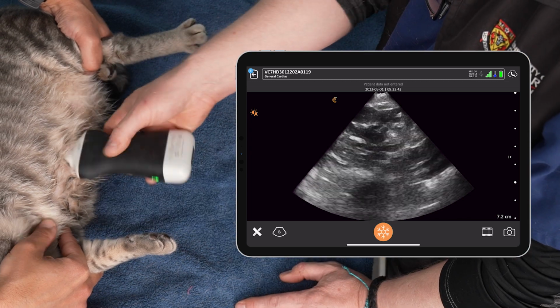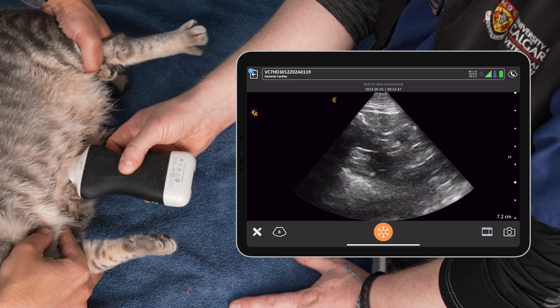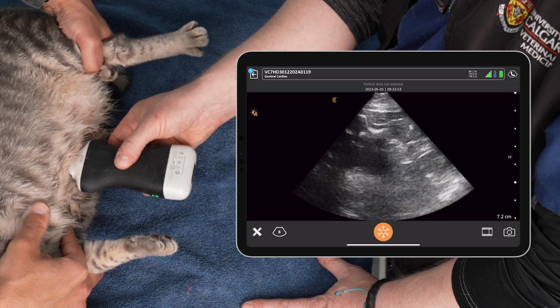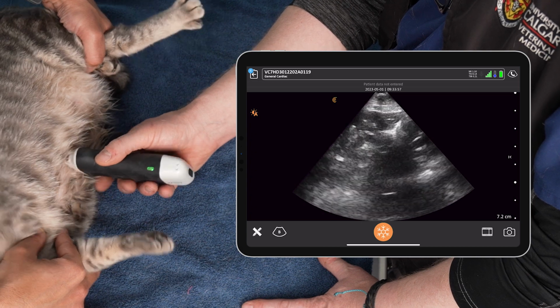This is different if our patient's standing. I want to come in with gentle pressure, not displacing that fluid, and I want to come in dead center on midline with a probe directed towards the spine if we're looking for fluid in a standing patient. So a little bit of a different technique in long and short axis between our standing and our lateral patients.